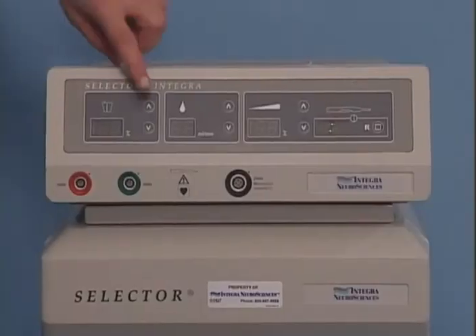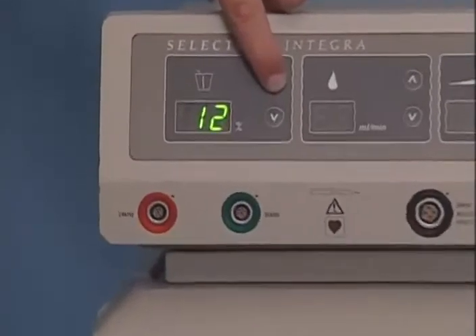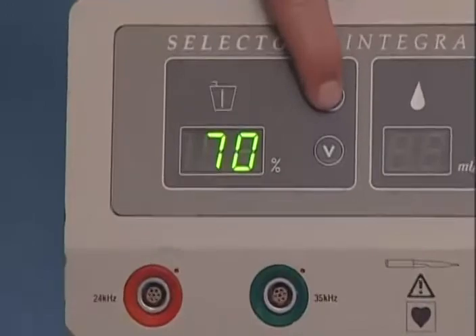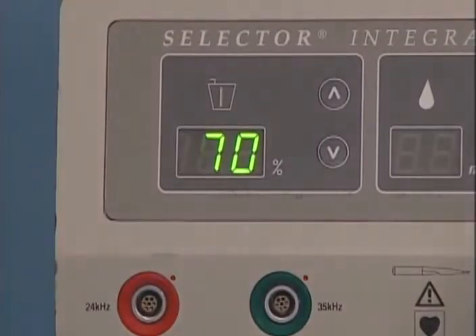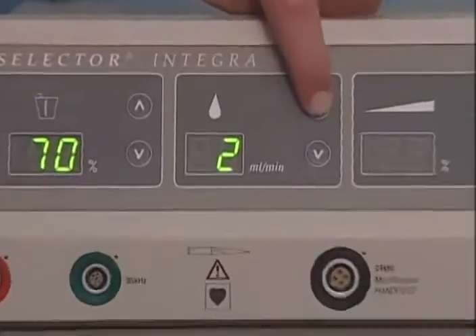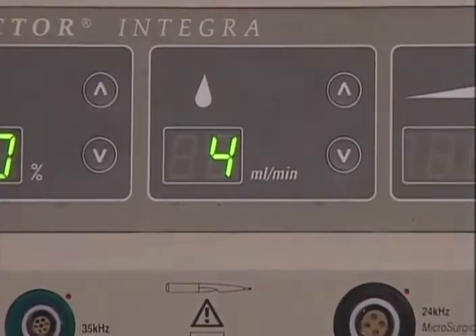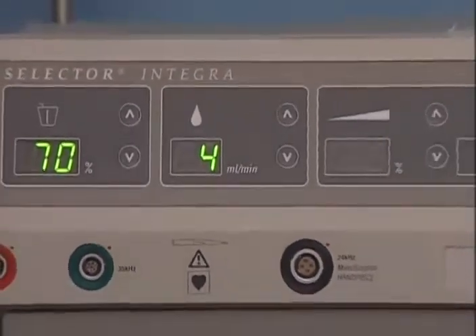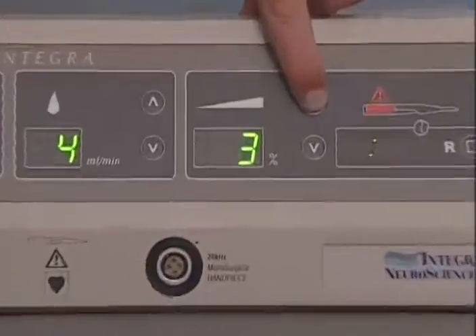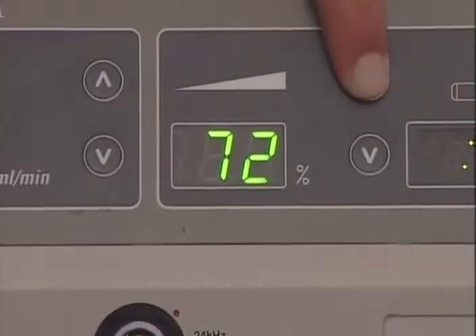On the front display panel, press the aspiration increase button to the desired setting. Typical aspiration settings are between 70% and 100%. Press the irrigation increase button to the desired setting. Typical irrigation settings are between 2 milliliters per minute and 8 milliliters per minute. Press the power increase button to the desired setting. Typical power settings are between 70% and 100%.